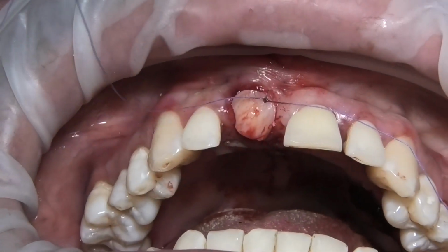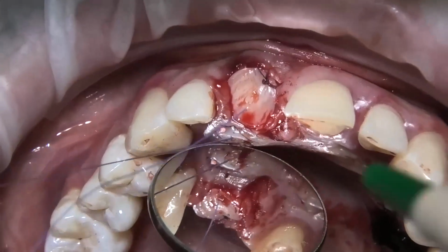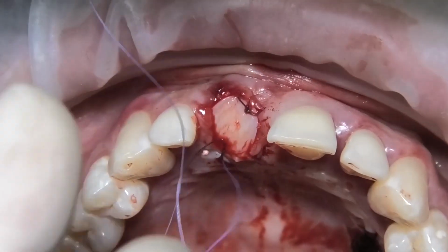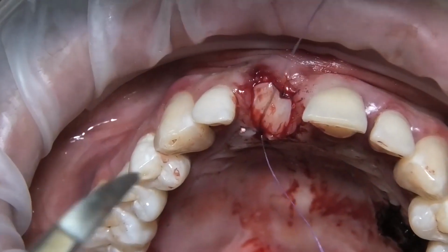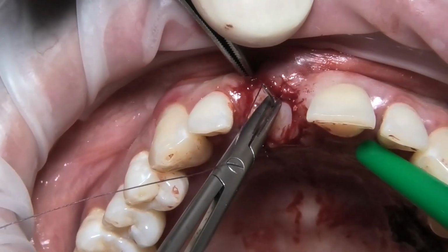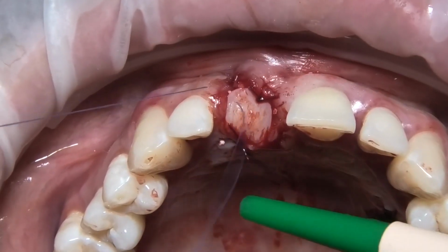First of all, mesio-vestibular and then distopalatal. So the graft is blocked in this position after the first two sutures. And then we can go to suture the other extremities, the other corners. So disto-vestibular, and after this, always from the graft to the flap, and the last one is mesiopalatal.